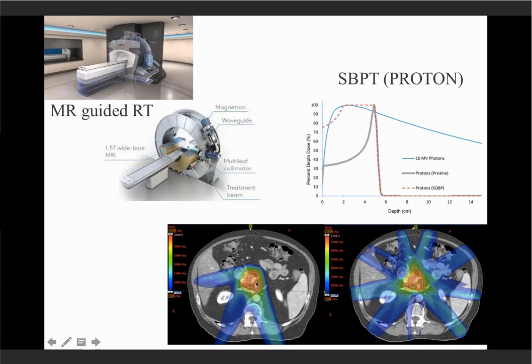So it's able to almost drop it off into the tumor, as opposed to a photon beam, where you have to add more beams coming in from different directions, and you're still going to get some exit dose. So again, heavy particles allow you to drop it a little bit more right where you want it. And also in theory, there are some improvements in the response of the tumor, in terms of how it kills the DNA of the tumor, although that's still being evaluated.